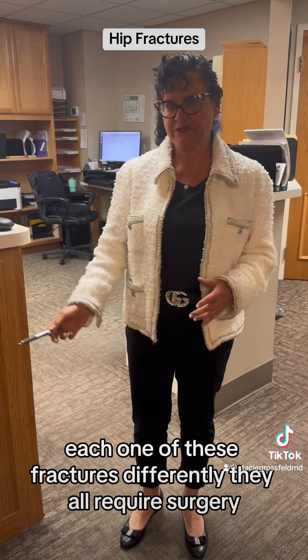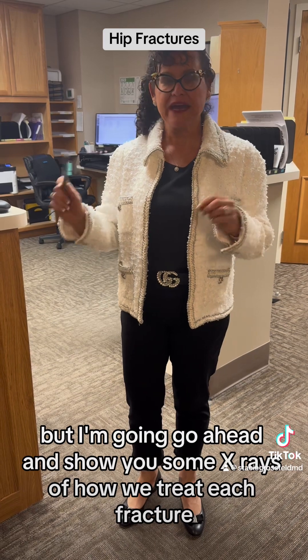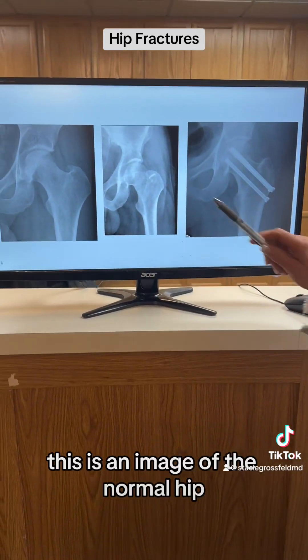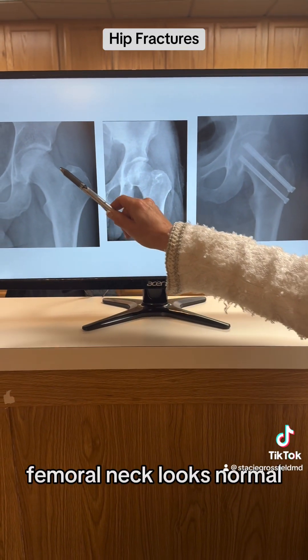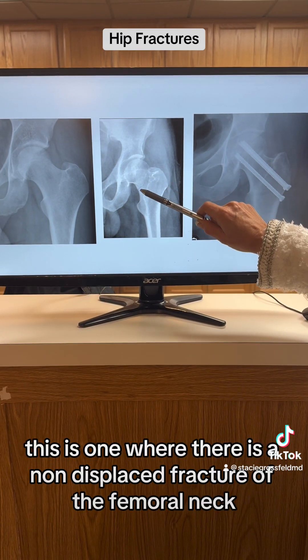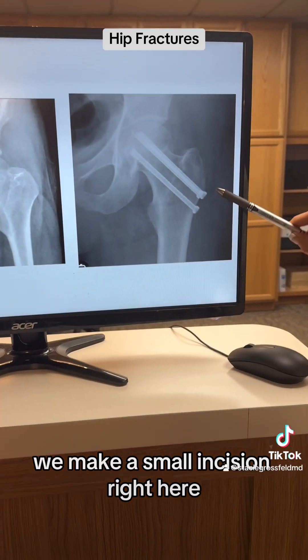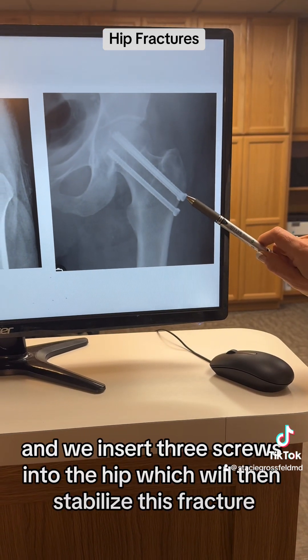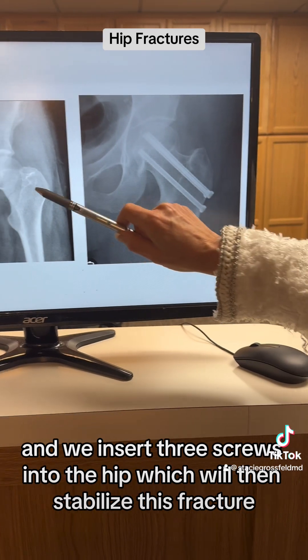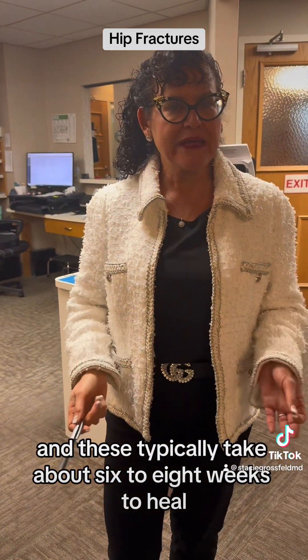Each one of these fractures differently, and they all require surgery. For the non-displaced femoral neck fracture, we treat this with something called percutaneous pinning. We make a small incision, usually no bigger than about two centimeters, and we insert three screws into the hip, which will stabilize the fracture. These typically take about six to eight weeks to heal.